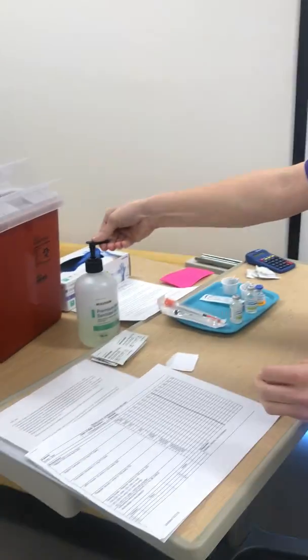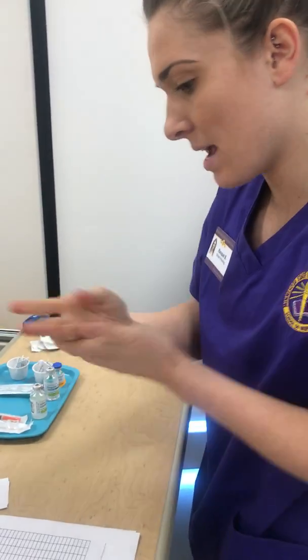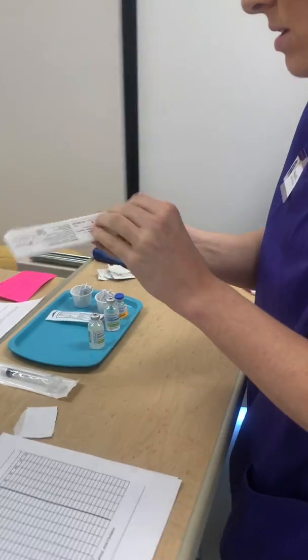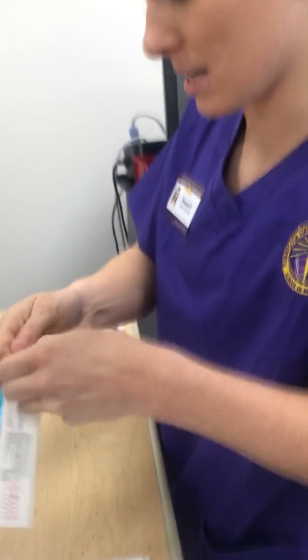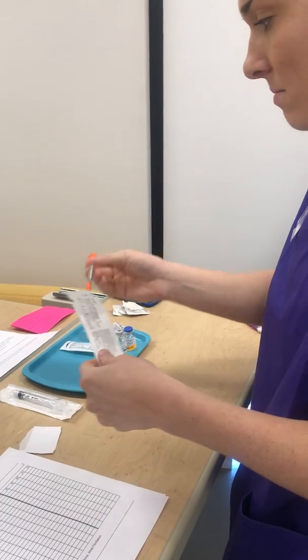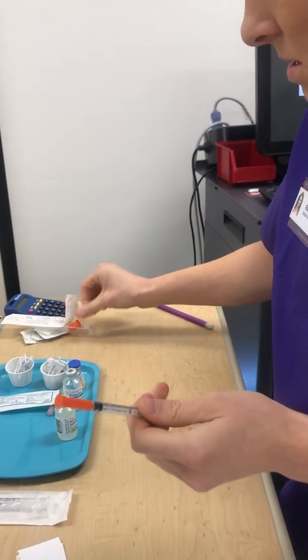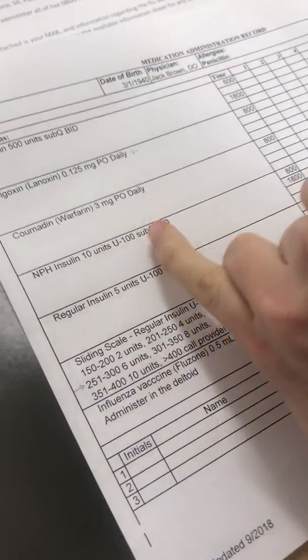So now I'm just going to wash my hands one more time. I just reconcile both my meds, and another nurse is watching me do this. So here we have a 27 gauge insulin only, so that's what we need. And then I'm going to open it away from me. Then pull out there. Then I'm just going to loosen this plunger up here. And so we need 10 units of U100.